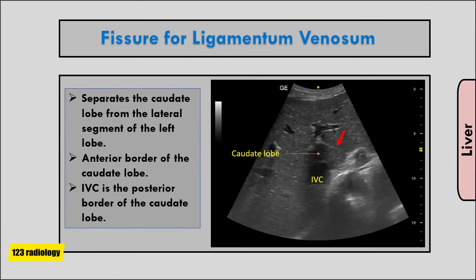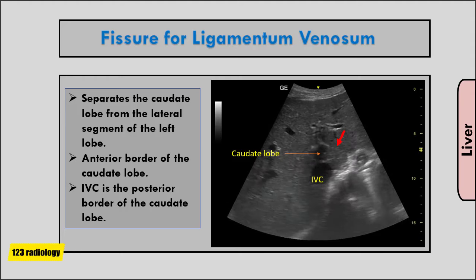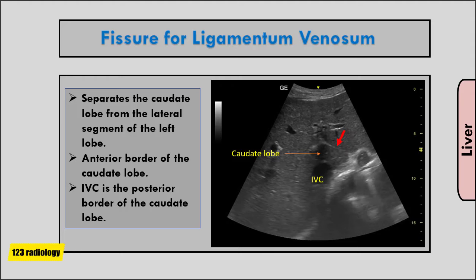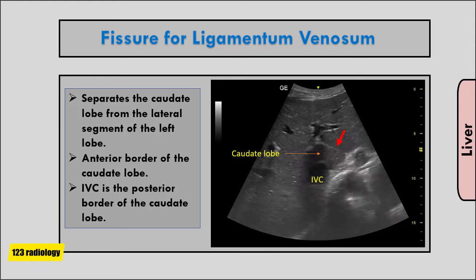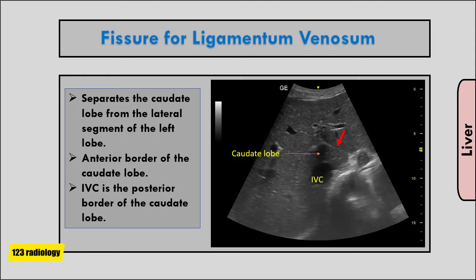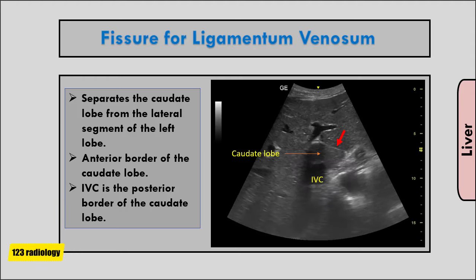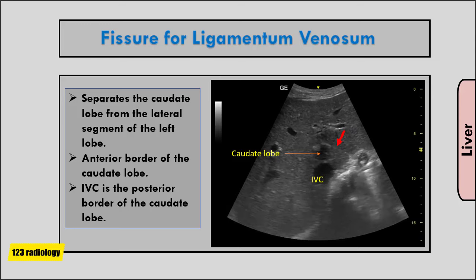Looking at more anatomy of the liver — the fissure for the ligamentum venosum is important because it separates the caudate lobe from the lateral segment of the left lobe. It is the anterior border of the caudate lobe, with the IVC being the posterior border of the caudate lobe.